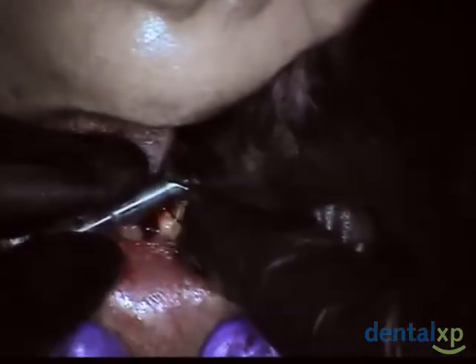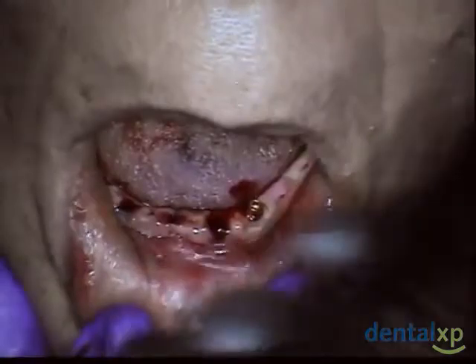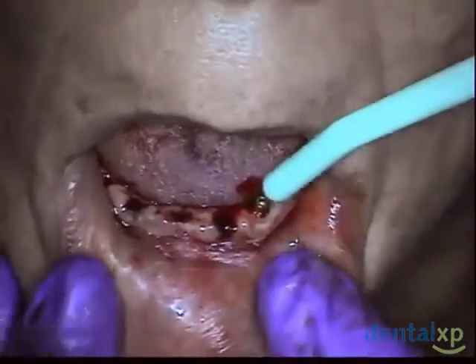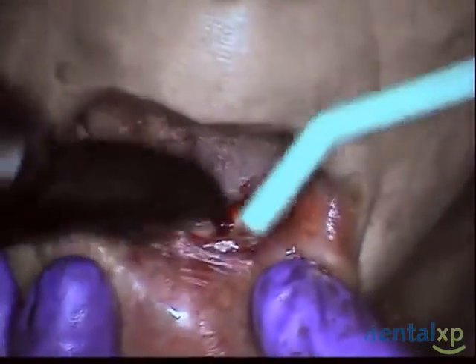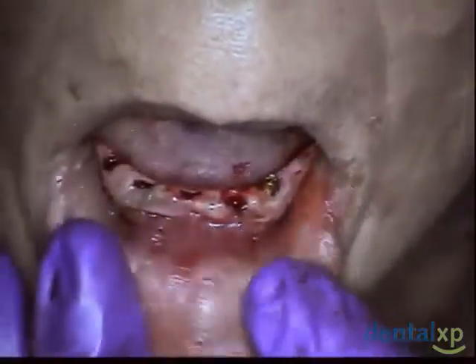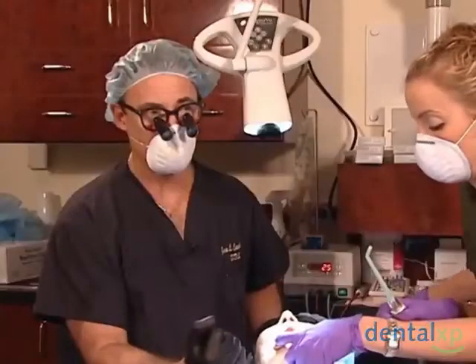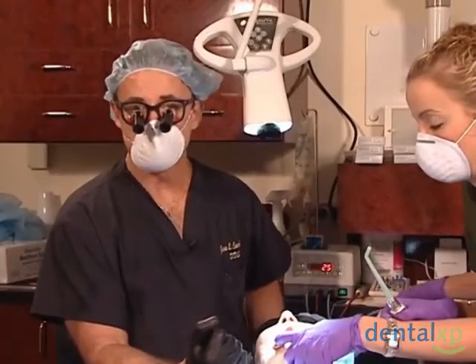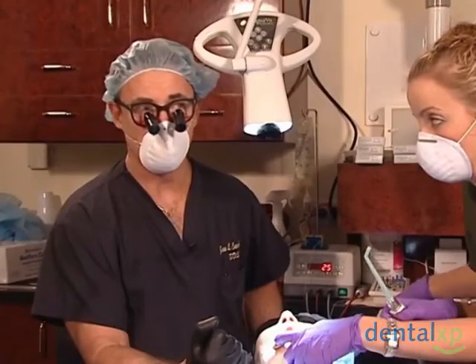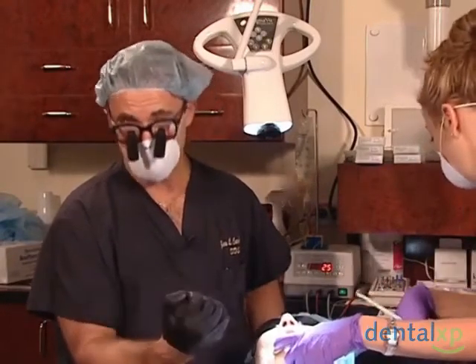And it starts getting a little tight. What I'm going to do is stop here. And if it's turning but not rotating, see, that was turning, but it didn't seem to go into the bone anymore. What would that mean? Well, that would mean probably I'm engaging that extremely dense cortical plate right at that area. And it probably would also mean that this implant is not able to engage it.